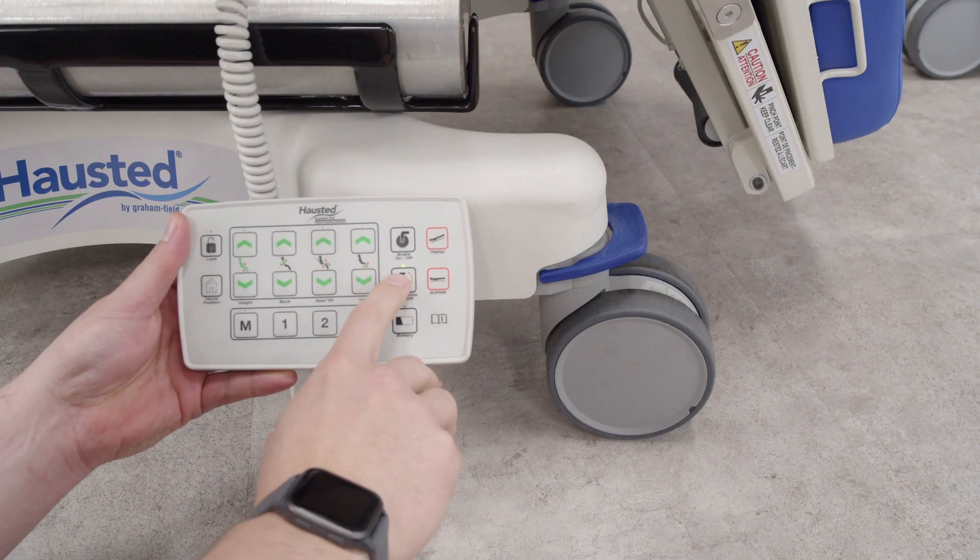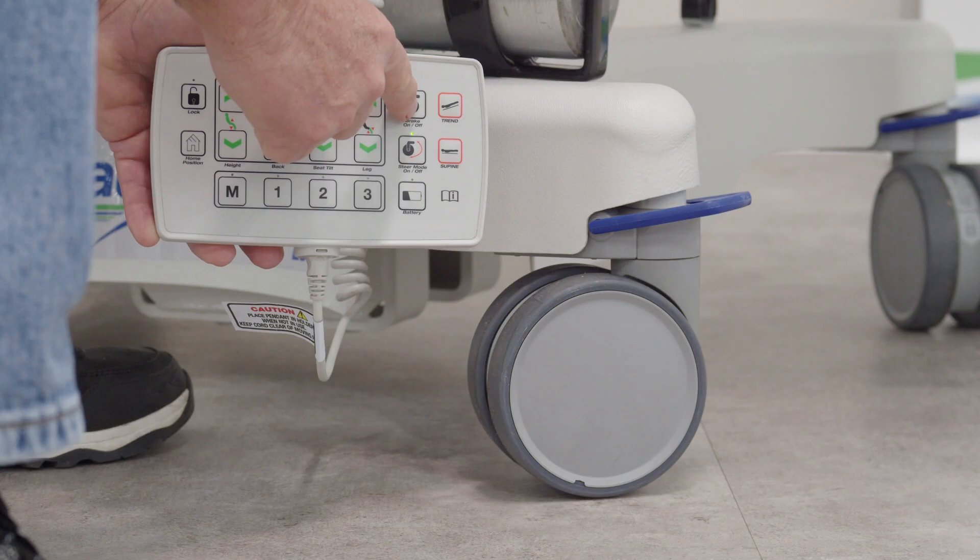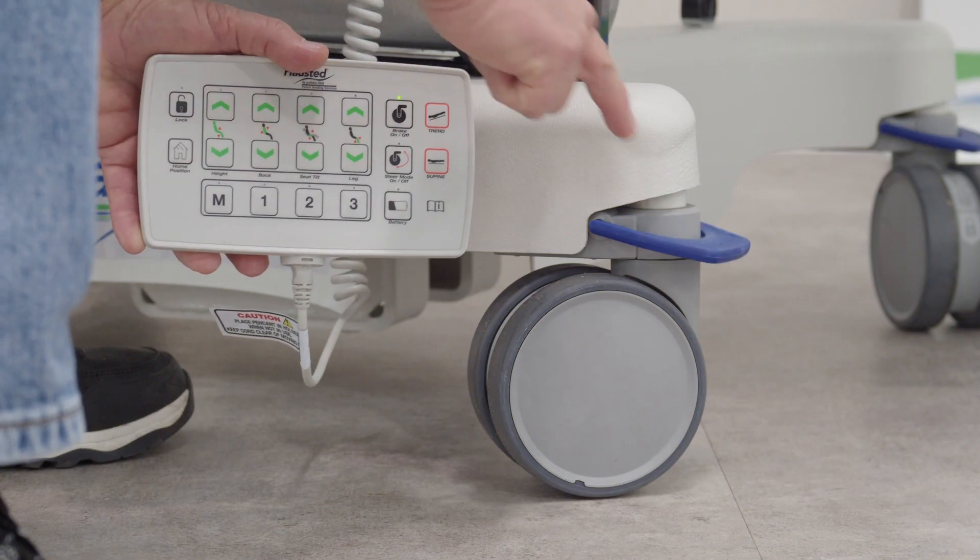From steer mode, you can either go back to neutral by pressing steer on the pendant again, or you can lock all four casters by pressing the brake button.